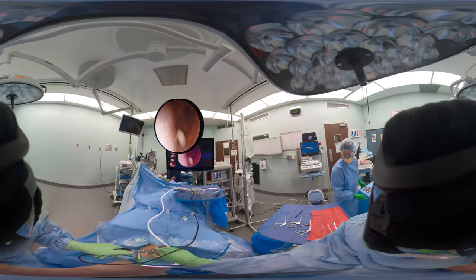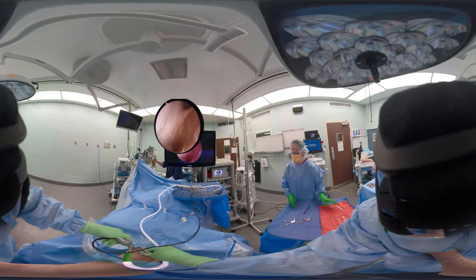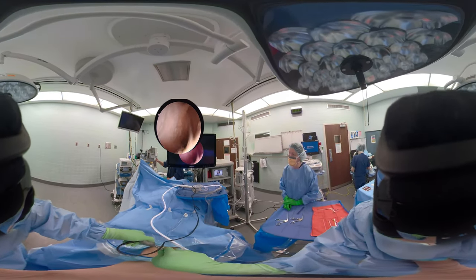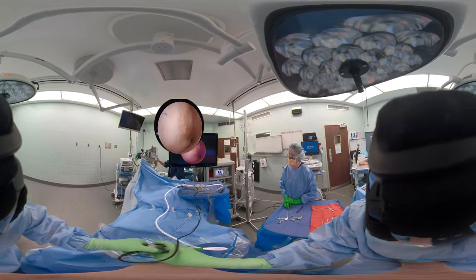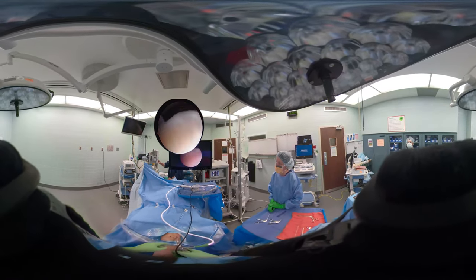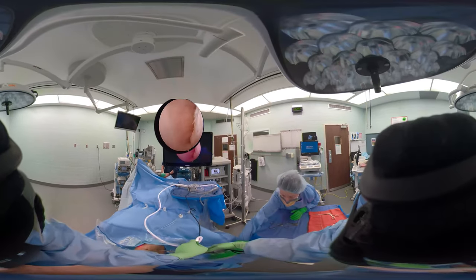Where there's one loose body there can be two, so we'll always look to make sure there's not another one. That loose body came off the medial aspect of her patella. This area is going down into where the popliteus tendon lives, in the lateral gutter. Loose bodies are often found in the suprapatellar pouch or one of the gutters — either medial or lateral.